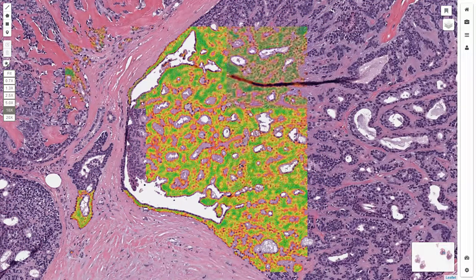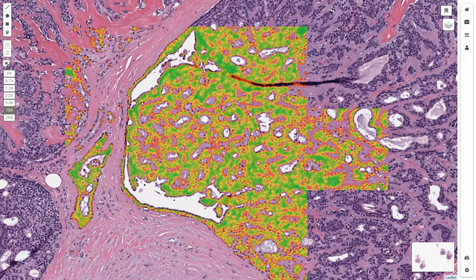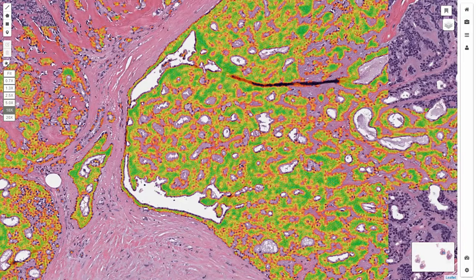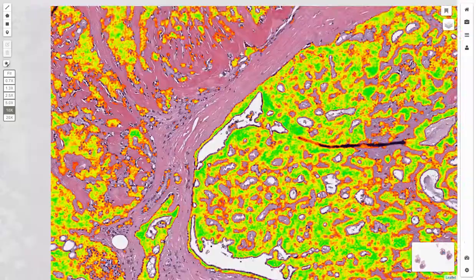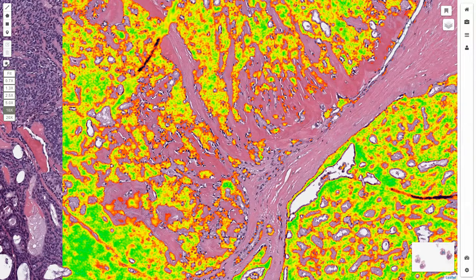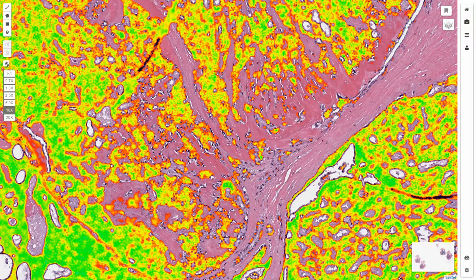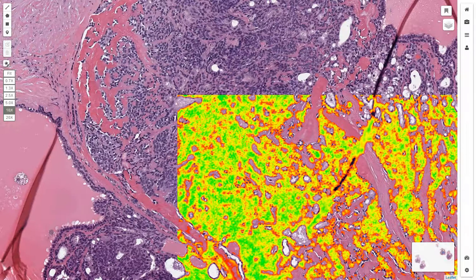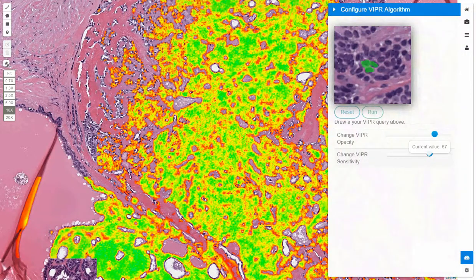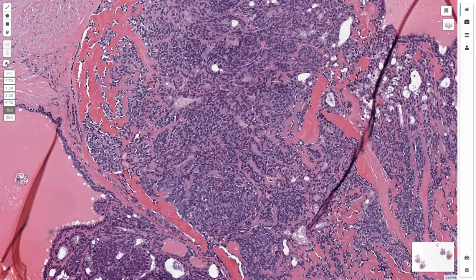In short order now, with a single training algorithm, we've identified a classifier which is finding all the malignant epithelium, and you'll notice it's avoiding the intraepithelial lymphocytes, which are of course a different category of cell type, which shouldn't be identified. I might have accidentally slightly overset the sensitivity. I will drop it. This should be an optimal compromise.